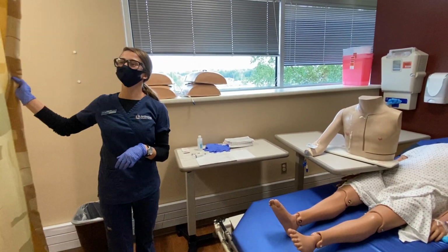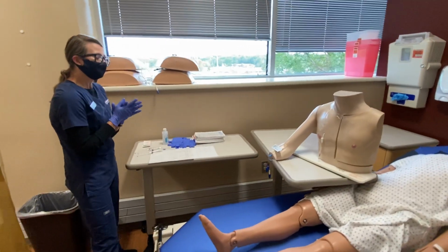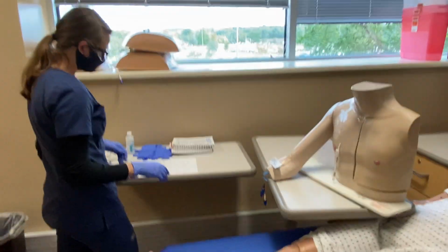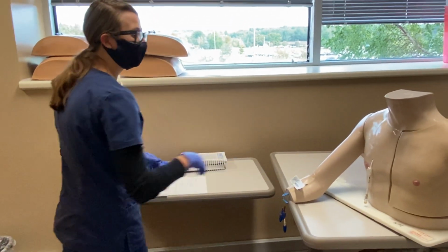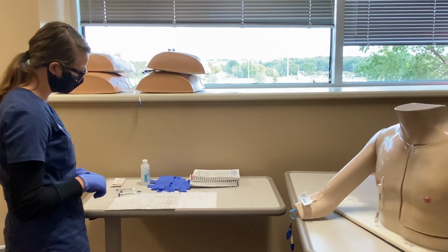Provide for privacy. I'm gonna wash my hands. Good afternoon, Mr. Owens. My name is Lexi, and I'm gonna be your student nurse today. Are you able to tell me your name and date of birth? He does, and it matches the mark. And Mr. Owens, are you allergic to anything? He is. He's allergic to morphine.